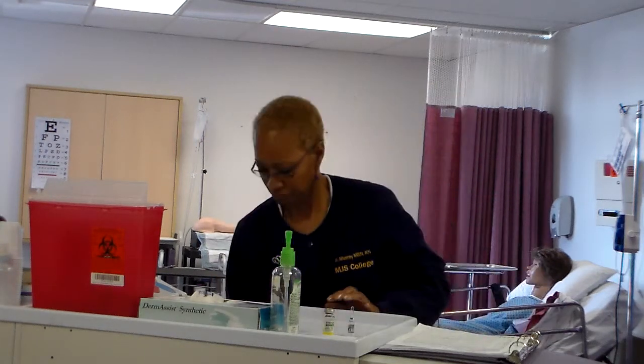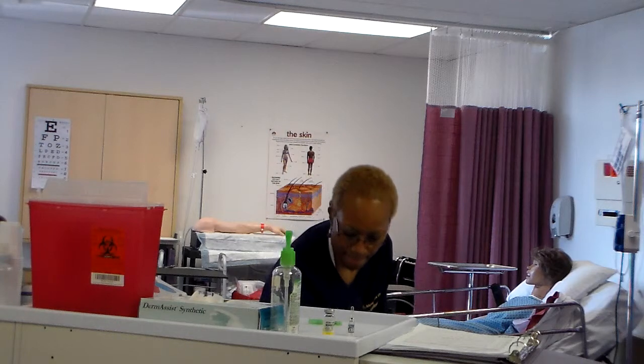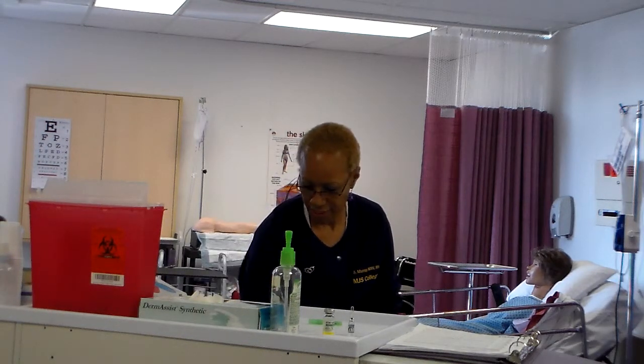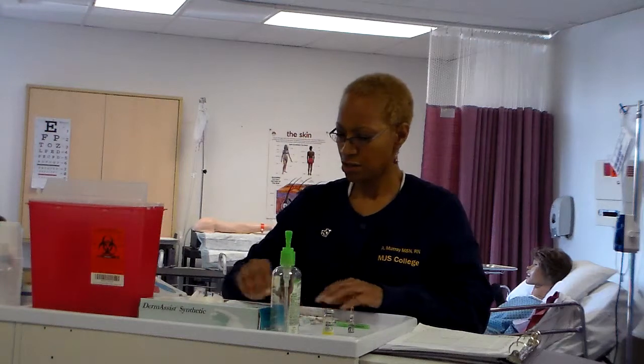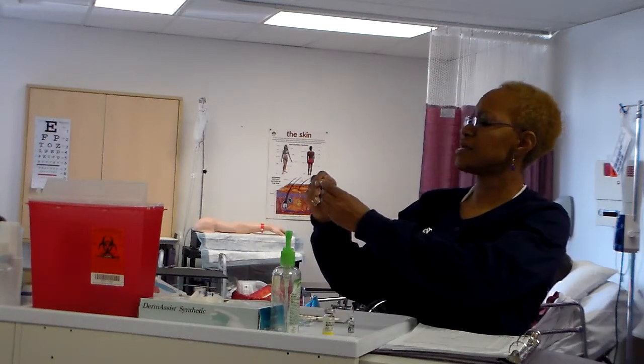Ampule preparation. We're going to do one at a time, so we're going to start with the ampule. Tap the top of the ampule lightly and quickly with a finger until fluid moves from the neck of the ampule. You're going to make sure that you obtain a filter needle in order to draw up your ampule. Your filter needle must say filter on it, whatever gauge you may have.